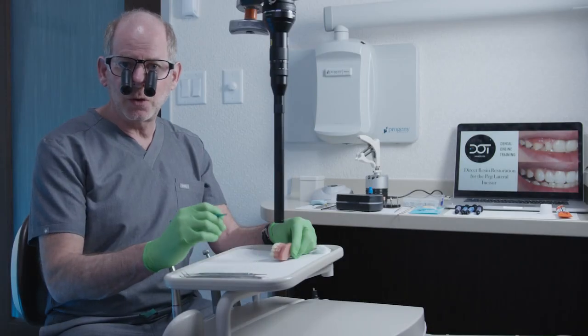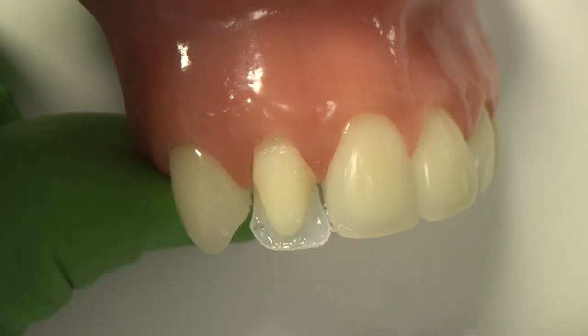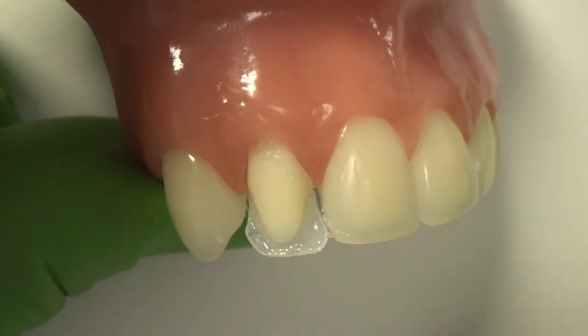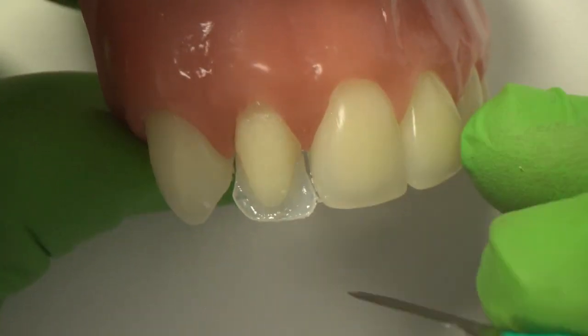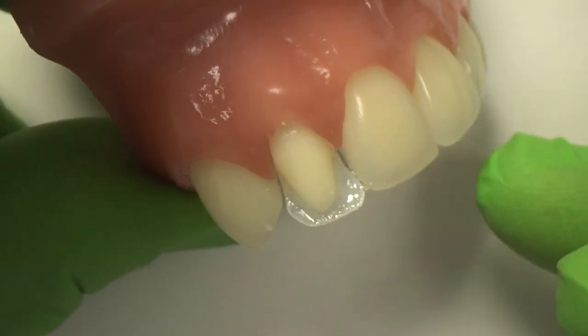It's not unusual where there'll be a little flash off the incisal. I got lucky on this one — it's really very clean — but typically there'll be a little flash that comes off, and that's probably happened to some of you. So just take that same blade that we used earlier and you can come in and literally just carve off any of the extra composite.